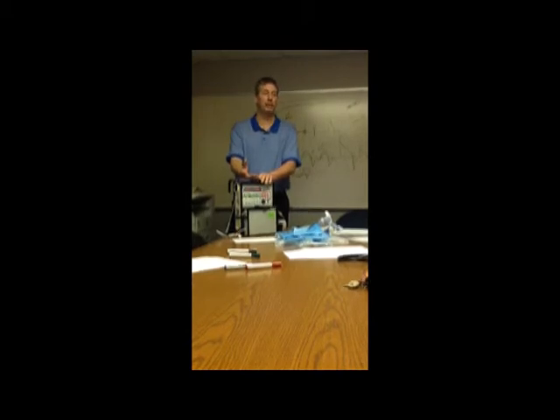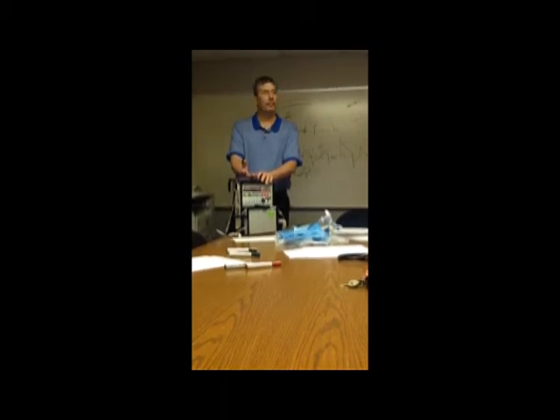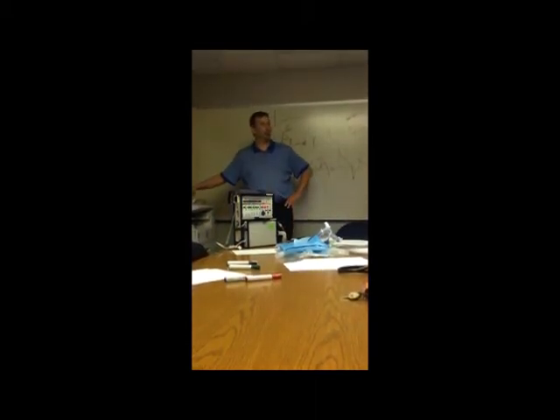If we do that, I want to go over other things besides this that might help you, like the thing about non-rebreathers. How many people in here knew that you have to crank a non-rebreather as high as it'll go? Don't be shy, raise your hand. I thought the big thing was the bag. I just looked at the breather bag. Yeah, and the bag means nothing. It did, you know, when you started 50 years ago. No, just kidding.